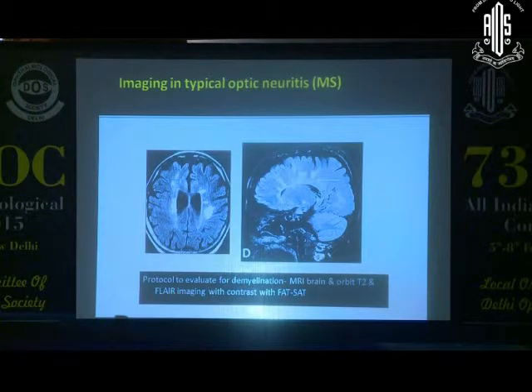Okay, these are the representative MR images. This is actually called a FLAIR sequence, in which this particular patient did show what looked like vertically or perpendicularly oriented periventricular hyperintensities, which were plaques. And the sagittal images, the midline sagittal ones, were almost diagnostic. What you see are foci of demyelination in the callososeptal or callosomarginal areas, which are almost diagnostic of established MS. Dawson's fingers, actually, they are called.